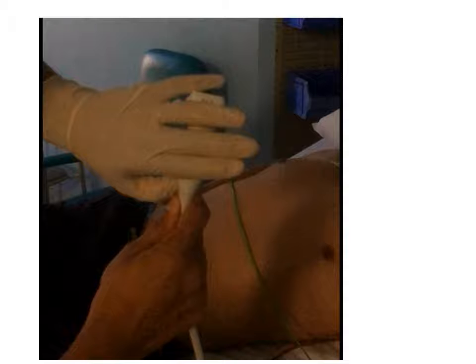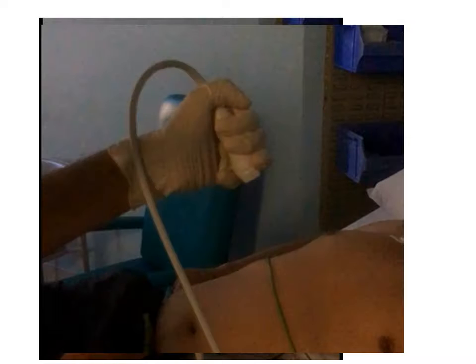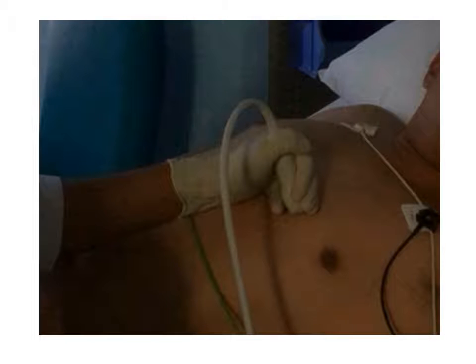If you were to hold the probe this way, it's going to be very firm and stable in your hand, like that. So now the probe cannot move. It's been held very firmly. When you put that on the patient's chest, what I would advise is that you keep the whole of the palm, including the wrist, onto the patient's chest.